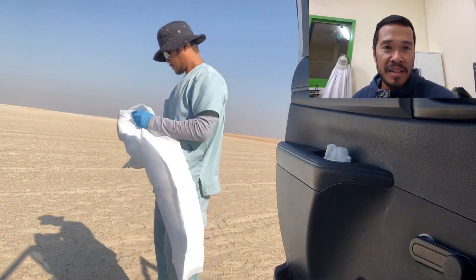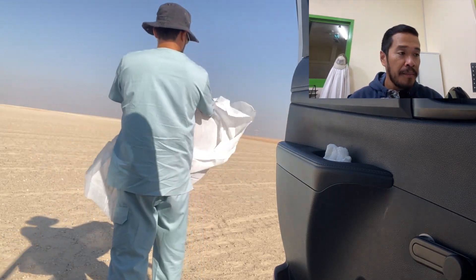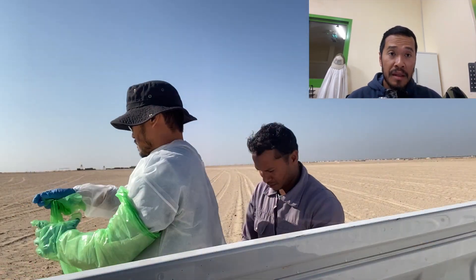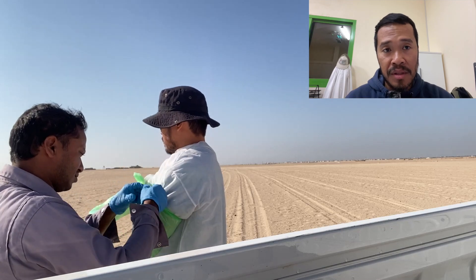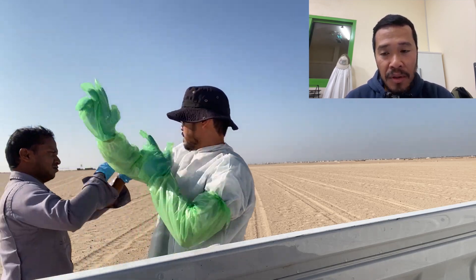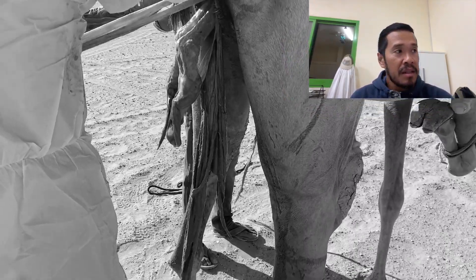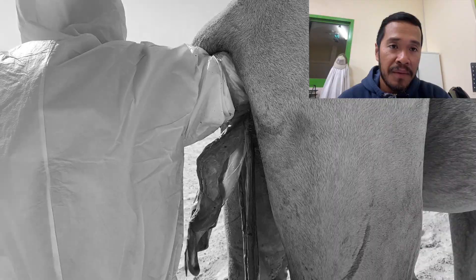Welcome back to the channel. I have another video to share, and this is about camel dystocia again — a different case than the one in my other video. This one involved a fetotomy procedure. According to Wikipedia, fetotomy is a veterinary procedure to recover a deceased fetus in situations where a cesarean section is not possible.